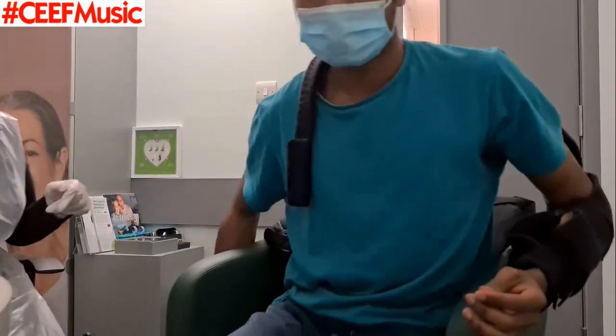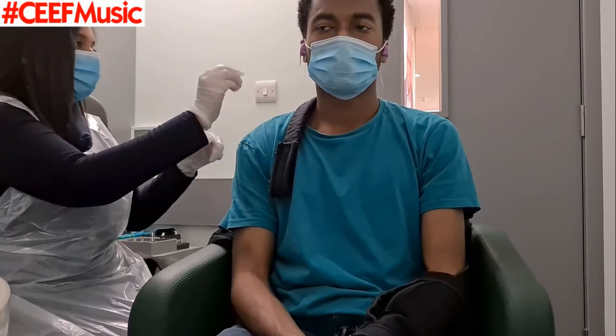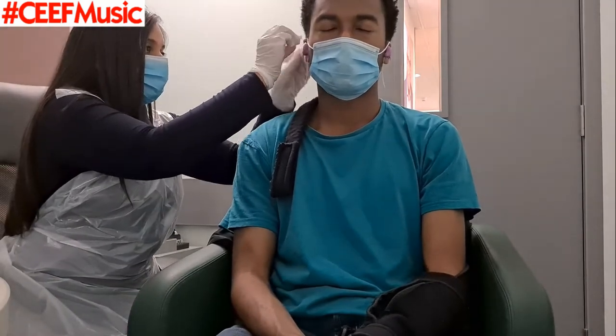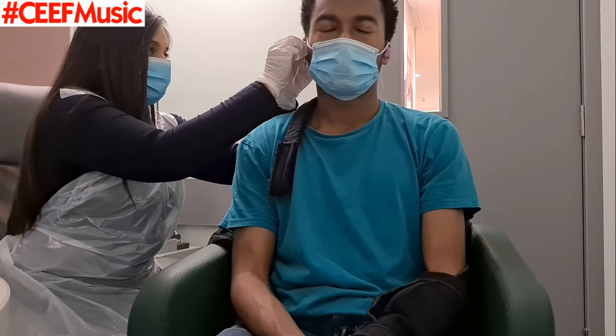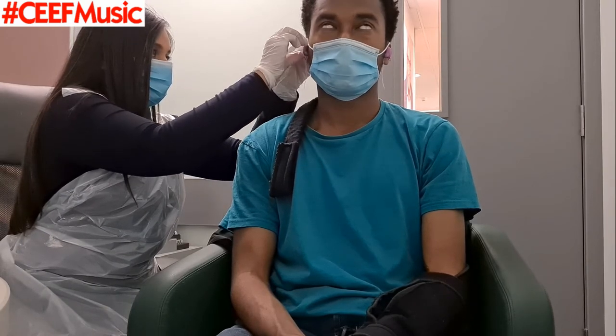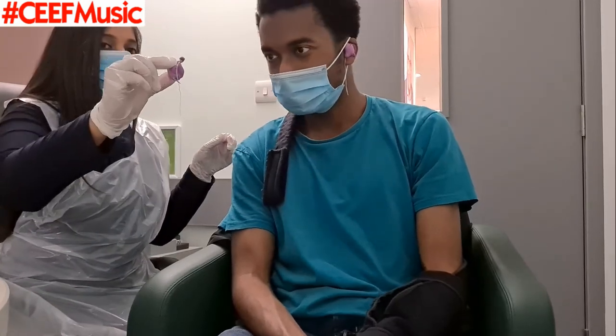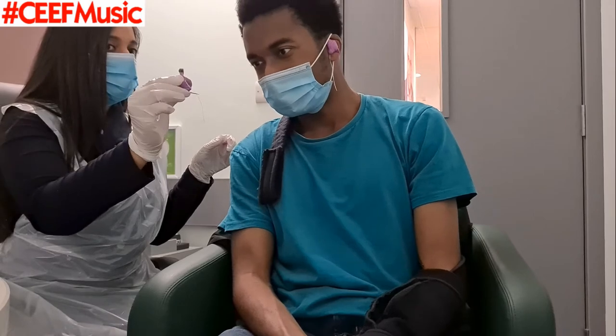I can't describe it. Imagine — I almost took it out myself because I thought she was trying to tell me to take it out, but no. She's just checked to make sure it's hard. And it was weird. Look at what happens to me — I can't describe this feeling when it's getting removed. So yeah, that's the shape of my ear, shape of my right ear right there.